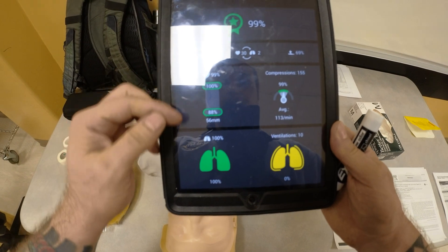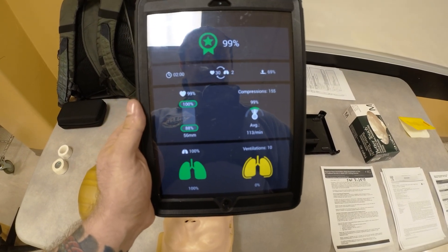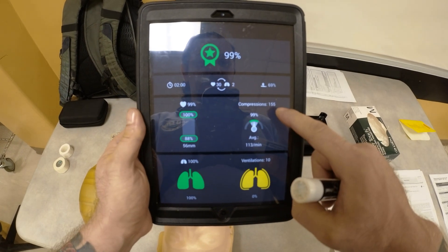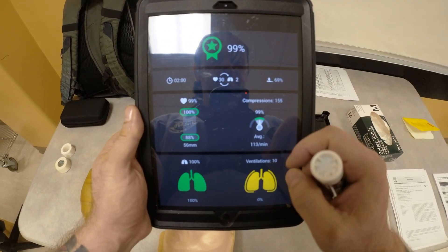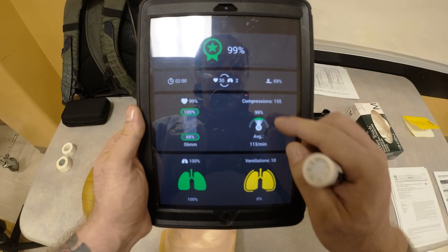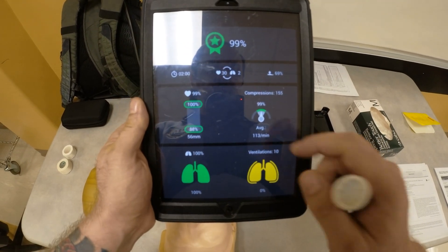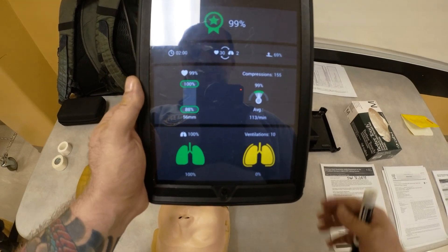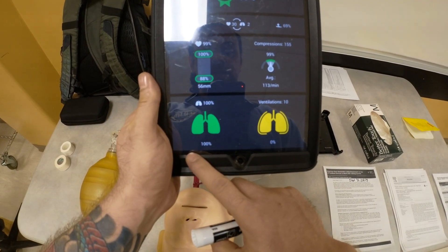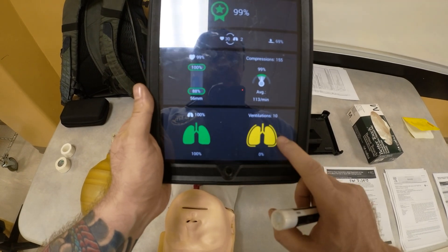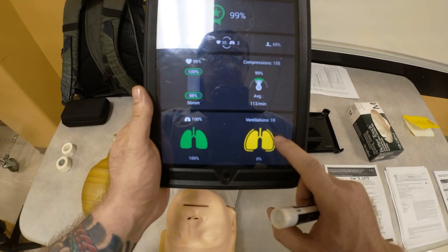It tells me my compression depth was 56 millimeters. It tells me that we did 155 compressions at 113 per minute — right in the ballpark between 100 to 120. We gave 100% ventilations that went in, and we gave 10 ventilations in total.